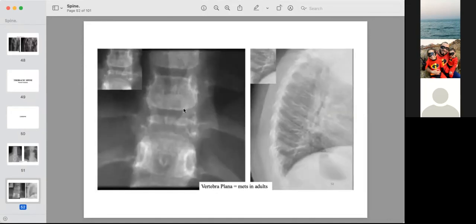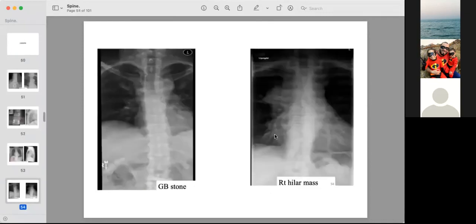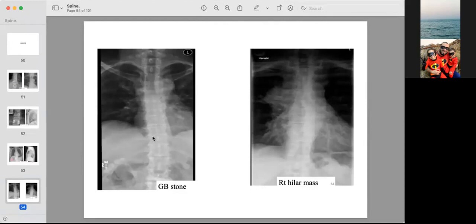A totally collapsed vertebra — vertebra plana — in adults should be checked for metastases. In sickle cell disease, multiple bone infarctions produce H-shaped vertebrae visible on the thoracic vertebrae, with superior and inferior end-plate depressions giving the H shape. Don't miss the rest of the film — here you can see a gallbladder stone easily missed if you concentrate only on the spine, and a right hilar mass also easily missed.